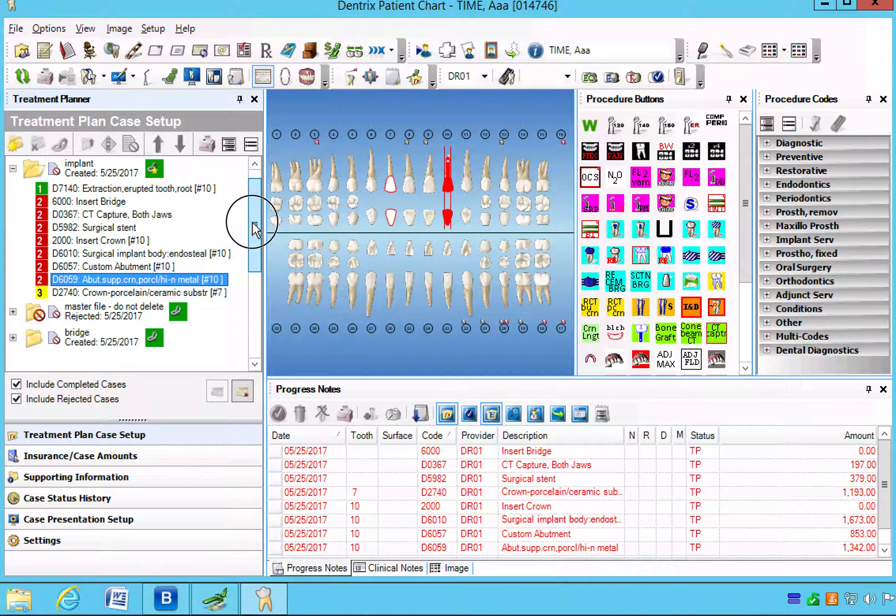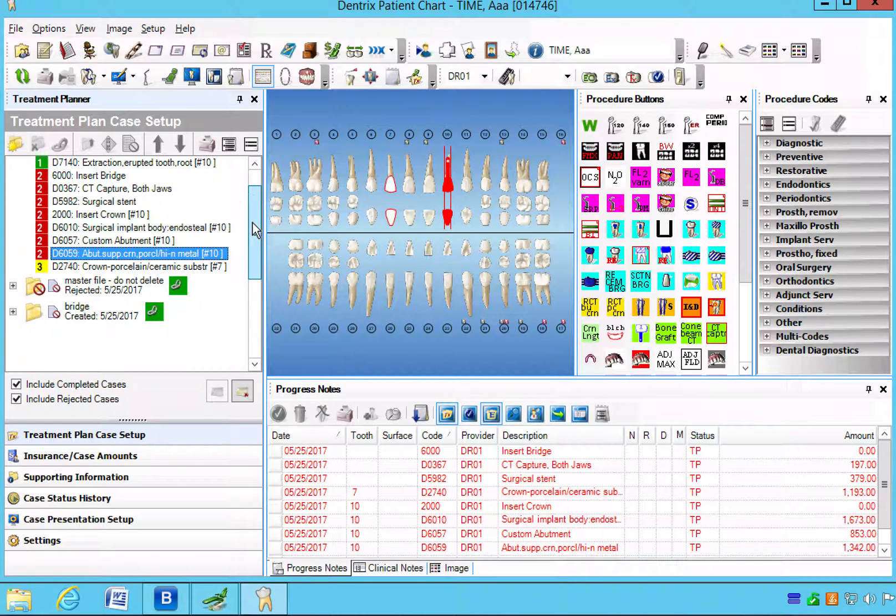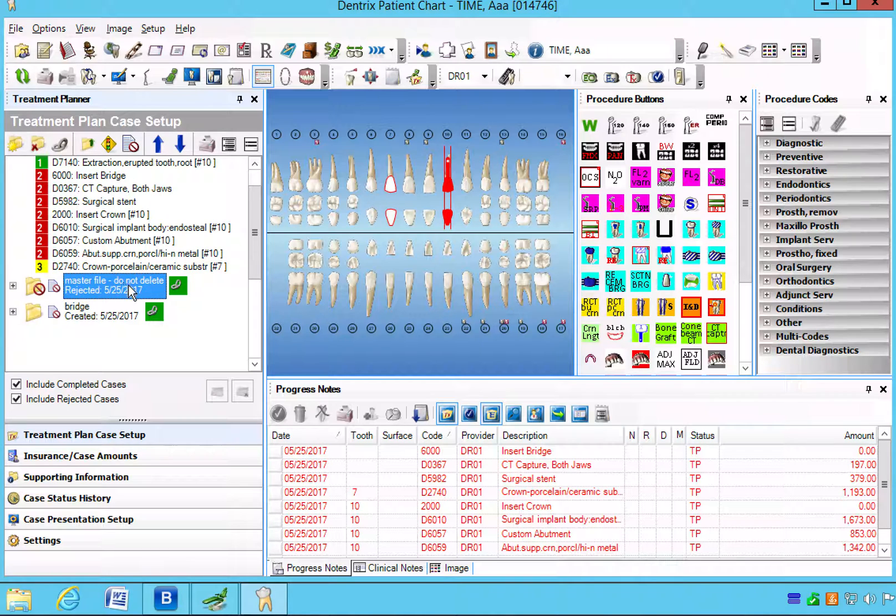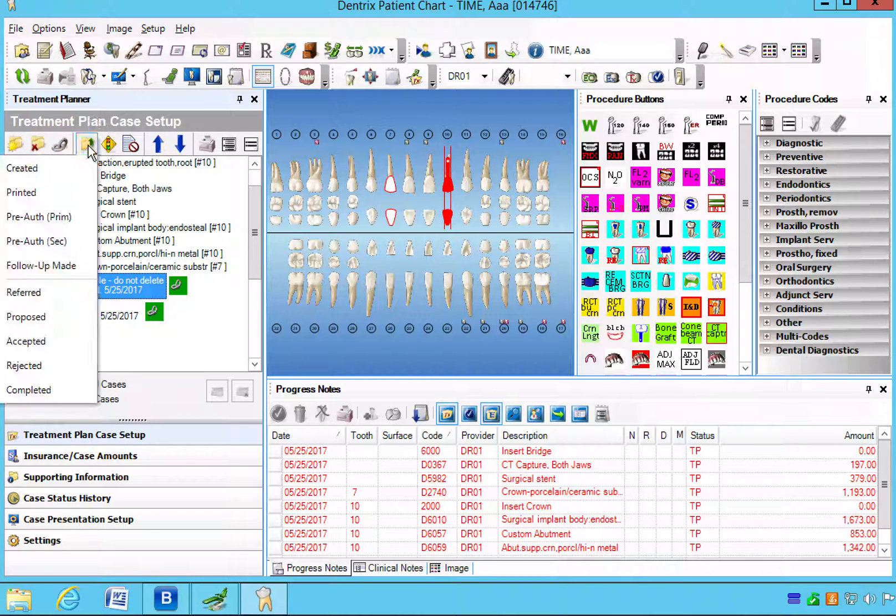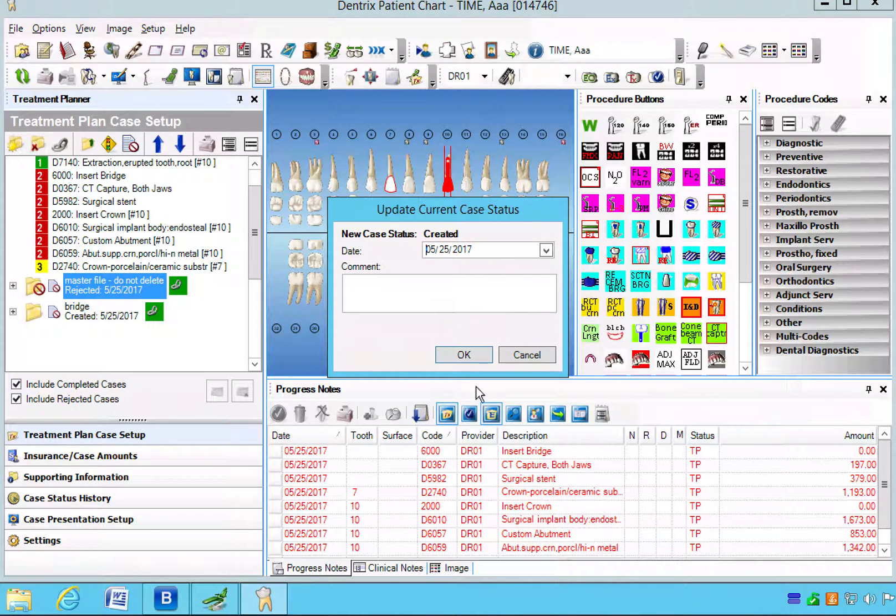If by chance we forgot or we need to update the case status to make it not rejected, you can go back into the update case status and change it back to created.